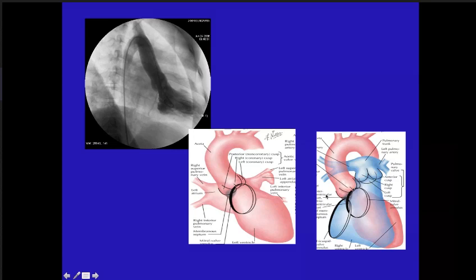Now, another important point which I will refer to again later in my slides. Now you see there's a coronary artery coming from here and going towards the left. I want you to tell me whether this coronary artery is in front of the pulmonary artery or behind the pulmonary artery. Behind the pulmonary artery, sir. Why do you say that? Because the aorta is posterior and the pulmonary artery is anterior. That's not enough. It can come from the aorta and then go anteriorly like this. Okay, just remember this. We'll come back to that figure a little later.